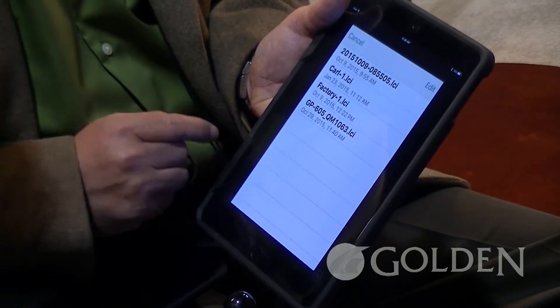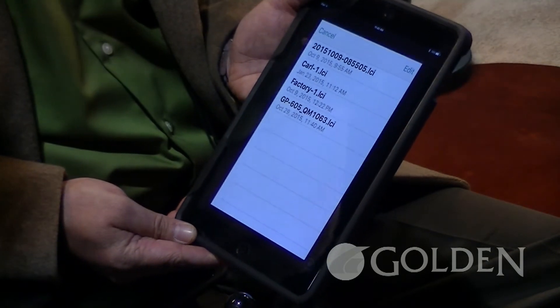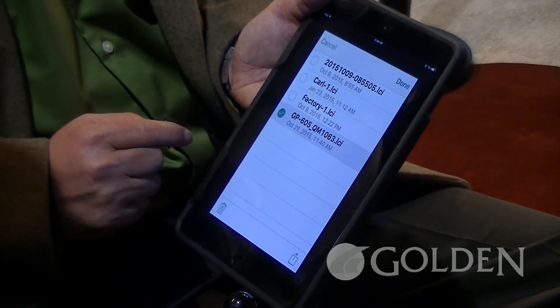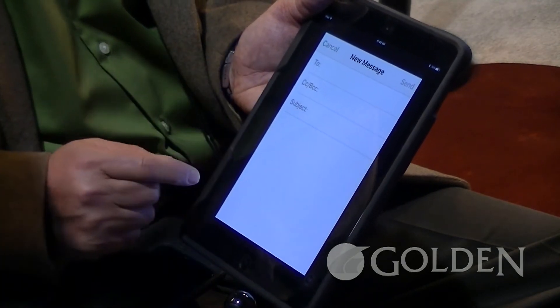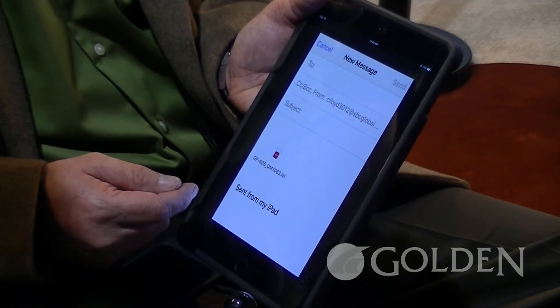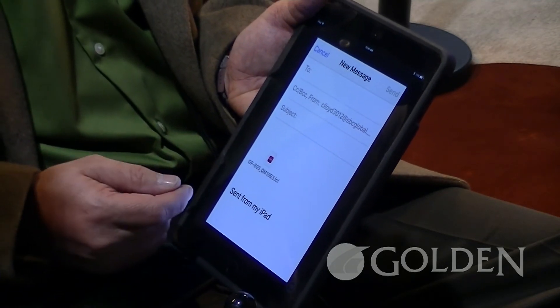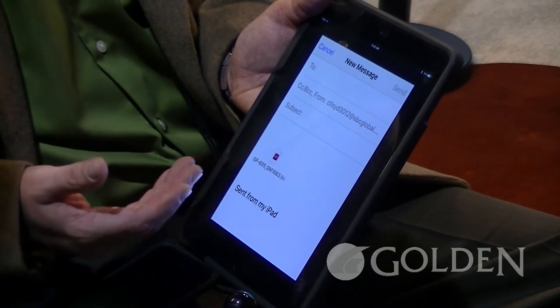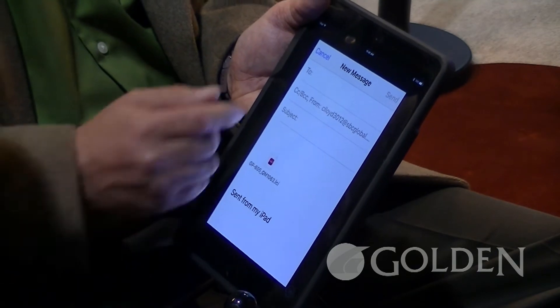A really neat thing about this system is that if there was a problem the technician could not figure out, we can simply go to edit, hit Mrs. Jones' chair, and now we can email this whole file of the chair's system back to Golden or to Dynamics and they can figure out what the problem might be. And if the clinician is involved, they can even send this to the clinician so they can keep a record of the parameters of the chair.